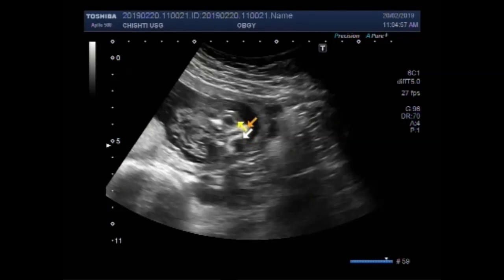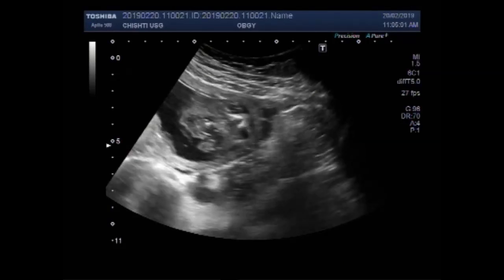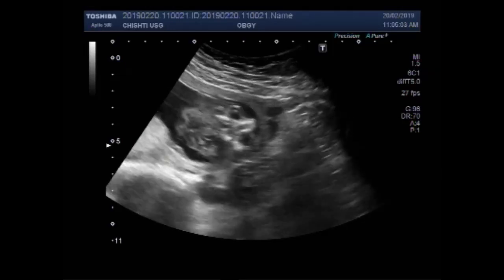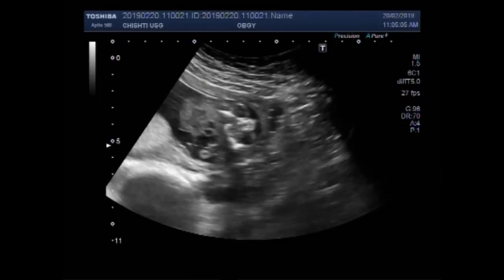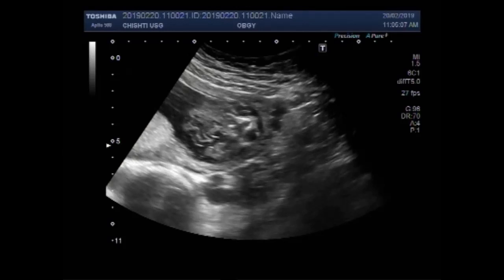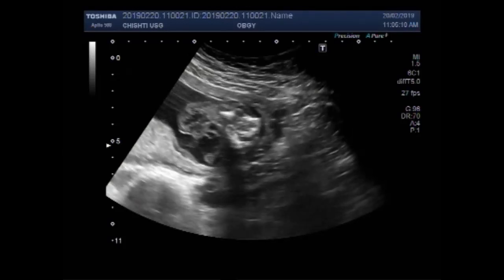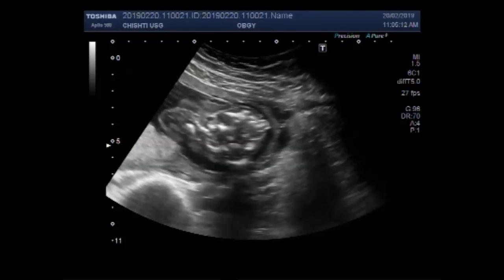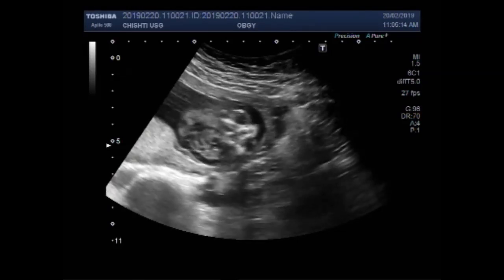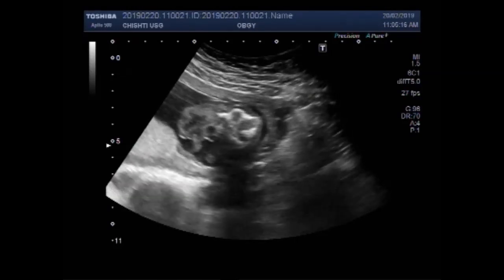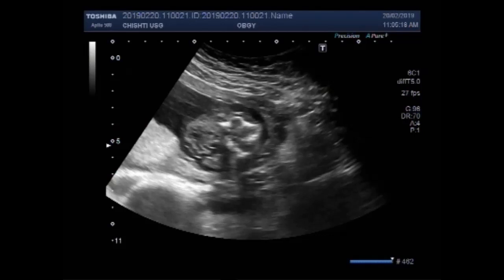These are both eyes of the fetus. This is the brain matter.